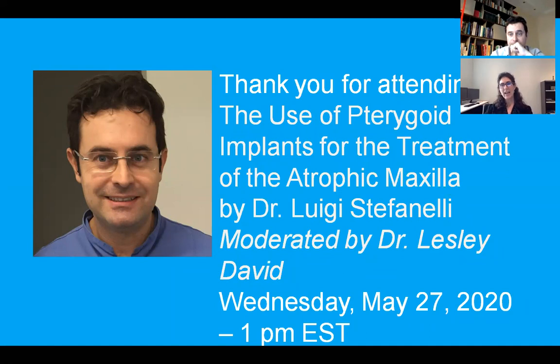Okay. And have you found in the past, I certainly have, cases where you plan using static guides very early on in the day, and the armamentarium used to place a static guide can be quite cumbersome sometimes. So you place the guide, you plan it on the computer, and then you get to the patient's mouth and you just can't actually execute the procedure because now there's no room for the guide, the extended drill, and so forth. So have you found that this has really allowed you to treat patients that otherwise you couldn't treat with this technology? Because let's face it, working in the posterior maxilla, it can be challenging. Now we're talking about posterior maxilla, it's even harder.